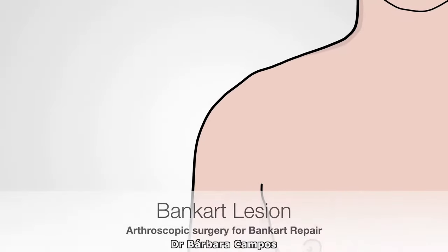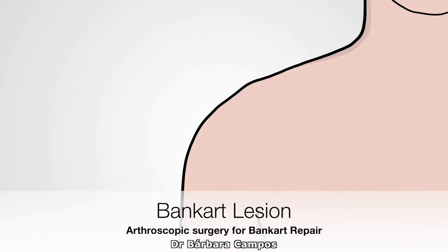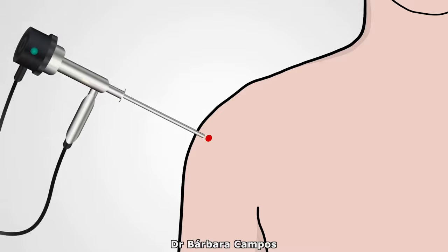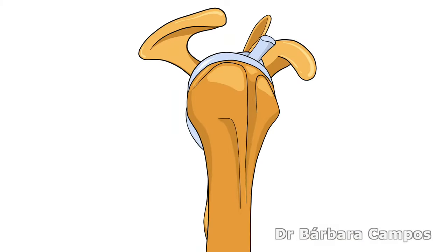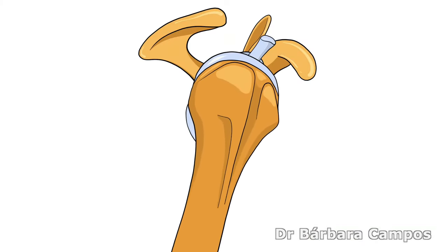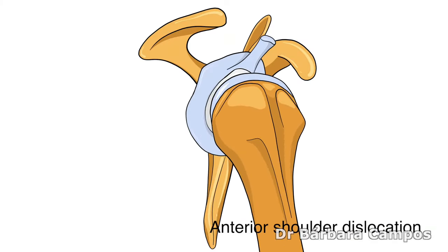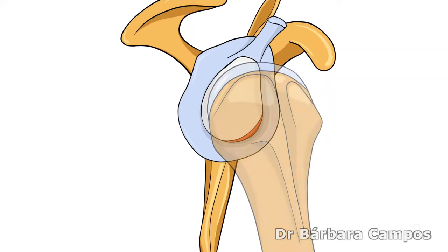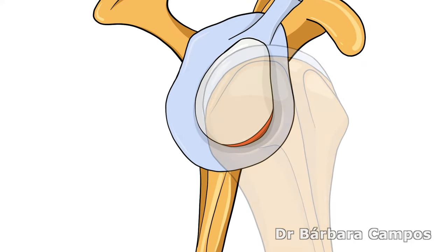We begin by making small incisions or portals where the camera and the arthroscopic instruments can enter the joint. The avulsion of the anteroinferior capsule is generally called a Bankart lesion.